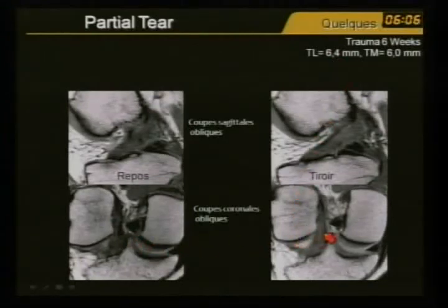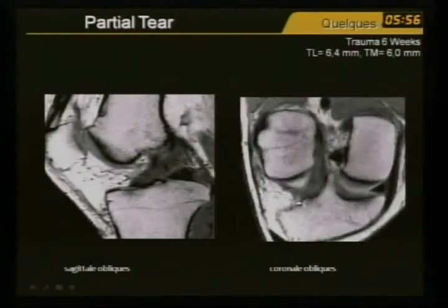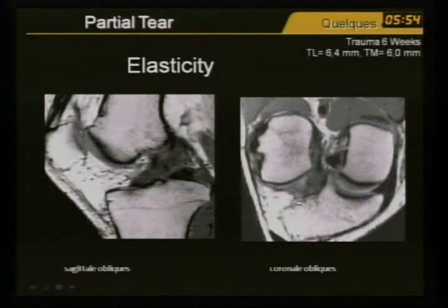You see also the tension of this ACL over there, and on the video analysis you will also be able to rate the elasticity of your remnant.